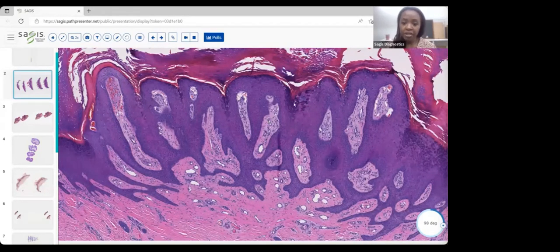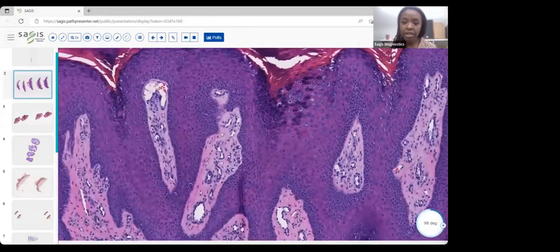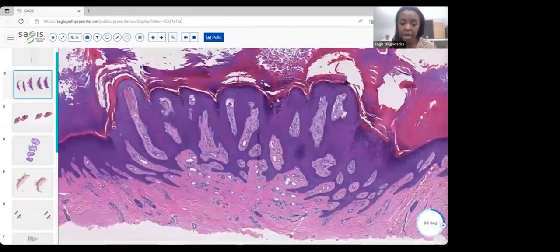One of the salient features that we appreciate on higher power is that once again, we have these coilocytes, these enlarged keratinocytes that have a clear or vacuolated cytoplasm and these small pycnotic nuclei, okay, and then we have increased keratohyalin granules and increase in this granular layer overall, okay, so those are the characteristic features. It is quite nice when we see those coilocytes so clearly.